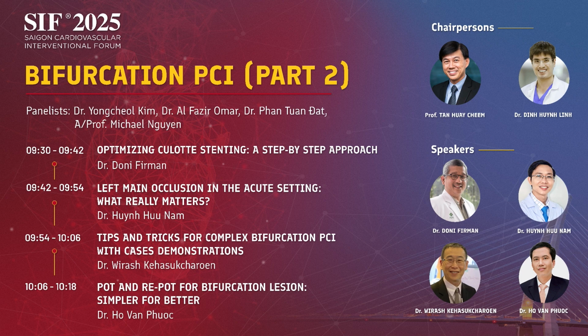So many confusions. Clearly, in the left main bifurcation, the ASAN data is just simply: circumflex is a 6, LAD is an 8, and the main is an 11. That's it. POT or not, and your conclusion is imaging guidance may be improved, but it is not.